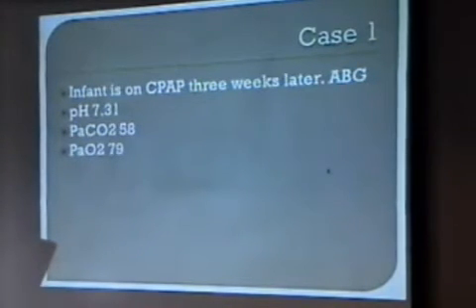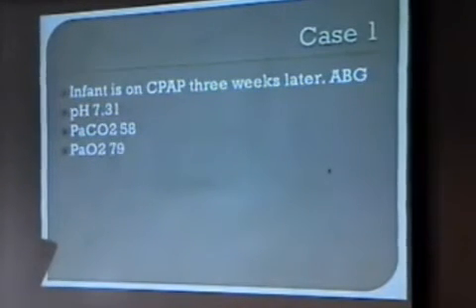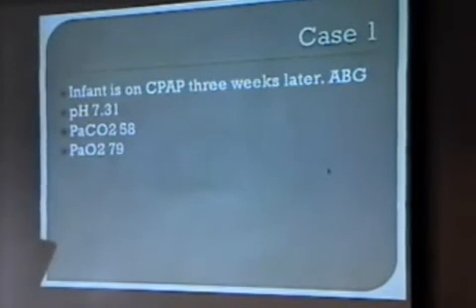How do you know it's compensated? Good. Okay, with the CO2 alone, let's assume it's 60, and the numbers are close.